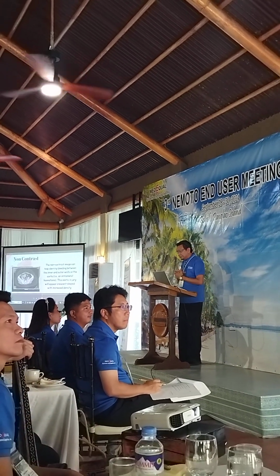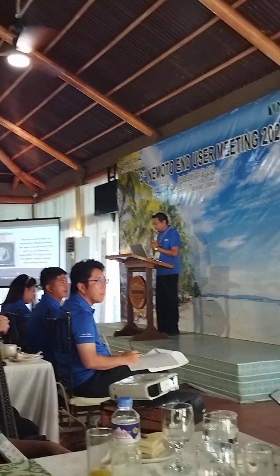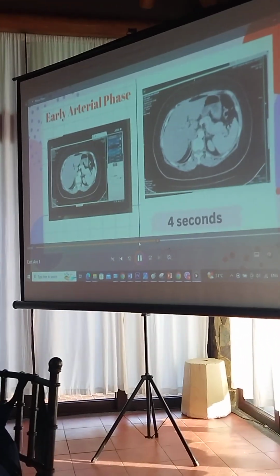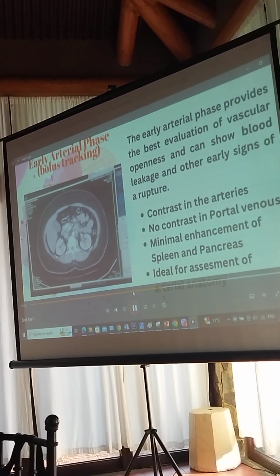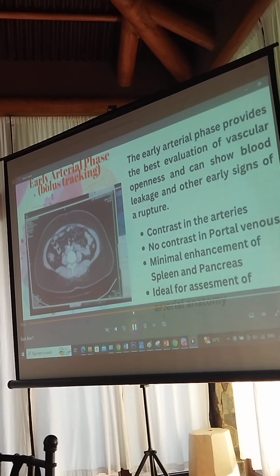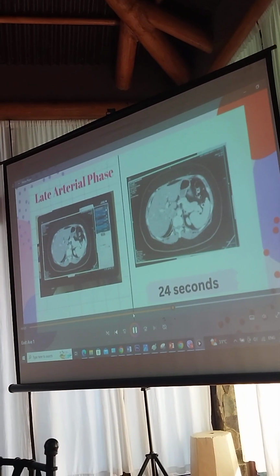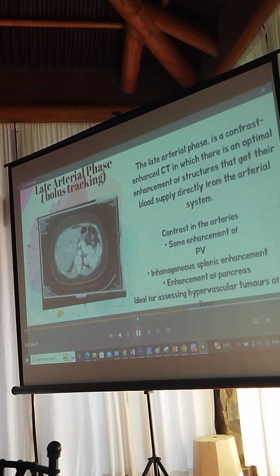So actually, each phase was carefully timed based on the contrast agent delivery, ensuring that the liver and other abdominal organs were visualized with optimal contrast enhancement. That is the objective of our power injector together with our CT scan machine.